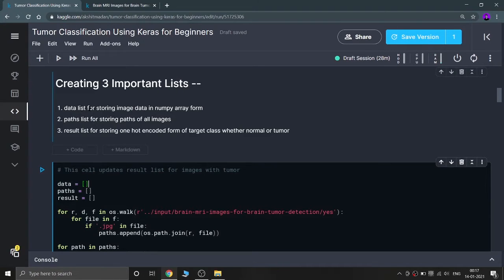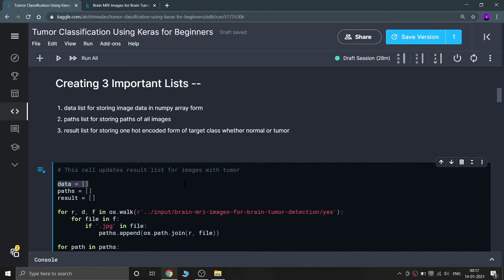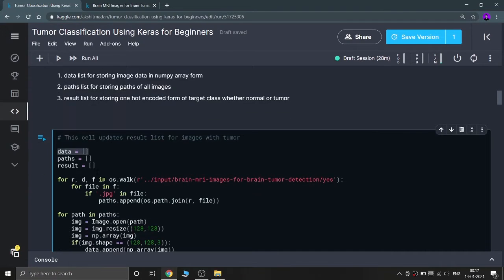The 'data' list will store image data in numpy array form — I can't feed raw images to my model, so I convert them to numpy form and store them in 'data'. The 'paths' list will contain the path of each image. The 'result' list will contain the target class — zero or one — where zero means tumor and one means normal. I'm using OneHotEncoder for this encoding.